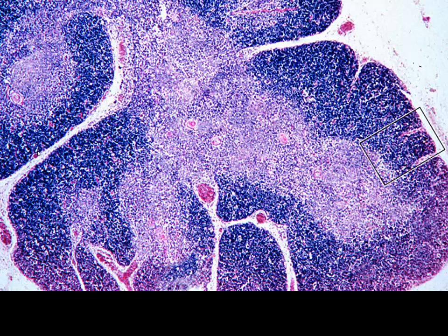Now, as we look at even higher magnification, again, the outer darker cortex, the lighter medullary area. But in this location, we can already begin to see these little concentric whorl-like structures, even though we don't see them in a lot of detail. Do you recall what we call these? These are Hassall's corpuscles. And as soon as you identify a Hassall's corpuscle, you know you're looking at thymus.